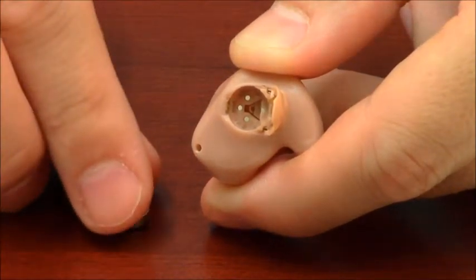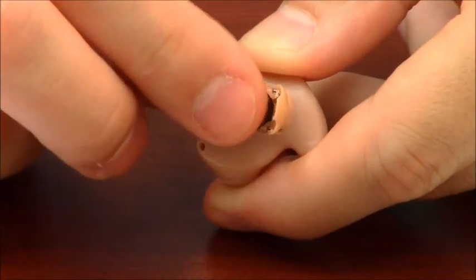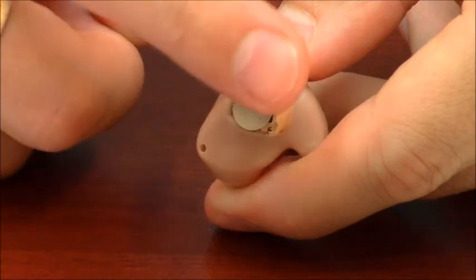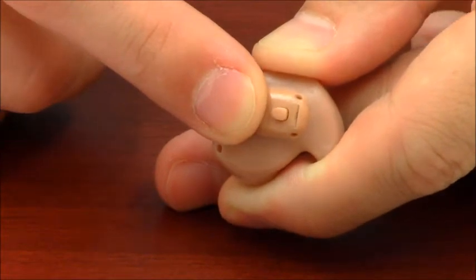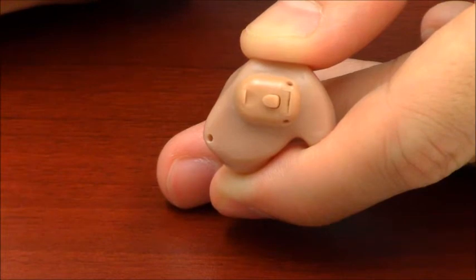You want to keep the flat side of the battery facing up, like so. Then you're going to close the battery door, and to lock it back into place, you're just going to push it in, which is the opposite motion you did to open the battery door.